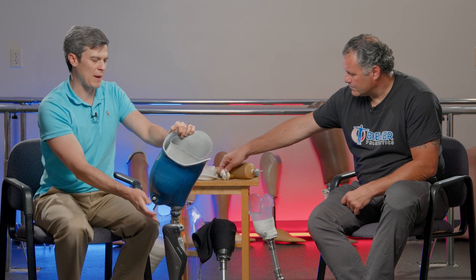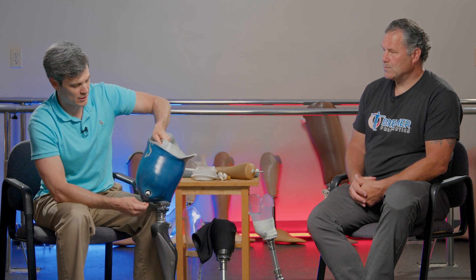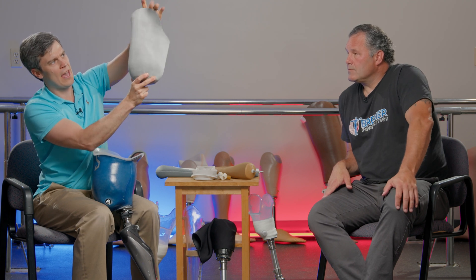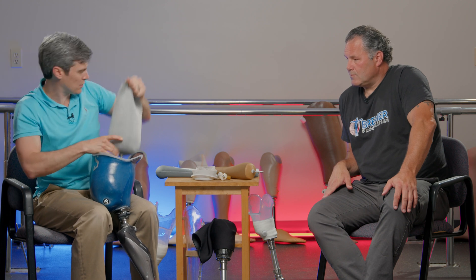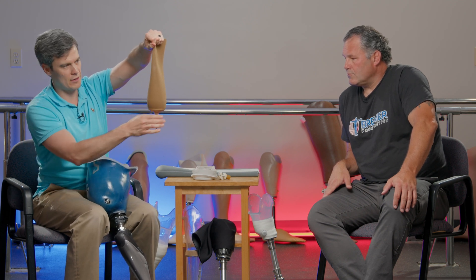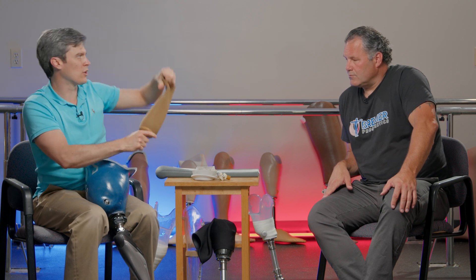This is a good suspension for people who are learning how to use their prosthesis. It does offer good positive suspension, but a drawback is that it only holds on at the bottom, so it does allow for some elongation. A lot of above-the-knee liners have been made with fabrics that prevent elongation — you can see I'm trying to pull this and it's not stretching very much. Whereas a below-the-knee liner used with an above-the-knee prosthesis would have a lot more elongation, so you wouldn't have as good a suspension.